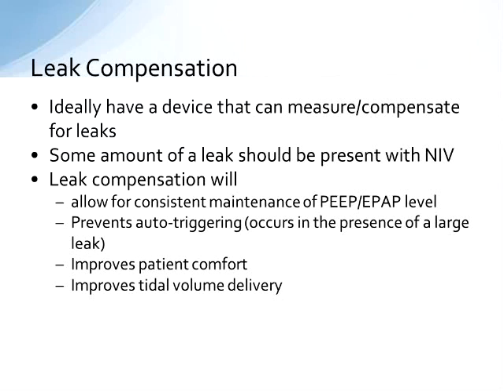I encourage you to grab whatever device that you're using at your institution and figure out exactly how it sets and how rise time is utilized. Same thing with e-sensitivity, and to know how leak compensation works with whatever device you're using in your institution.